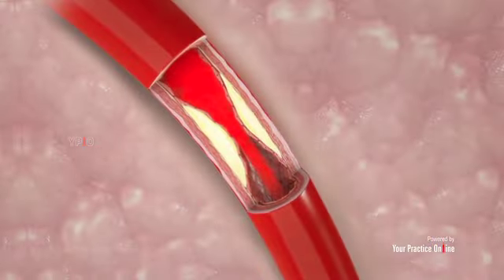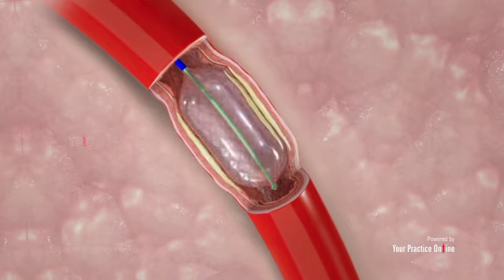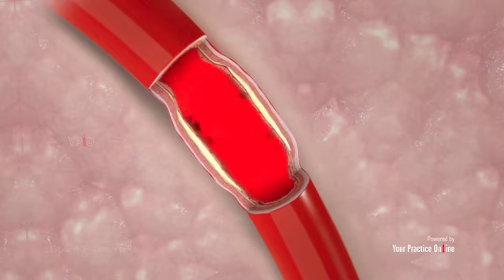A balloon catheter, thin tube, is then threaded through the guide wire to the narrowed artery. The balloon catheter has a deflated balloon at its tip, which is inflated at the site of the blockage. The balloon widens the artery by compressing the plaque against its inner wall.